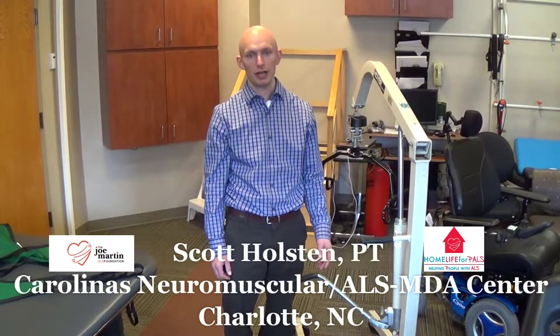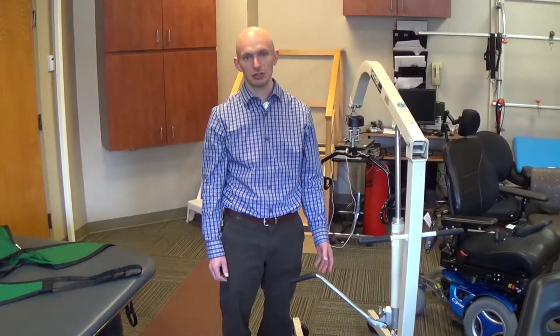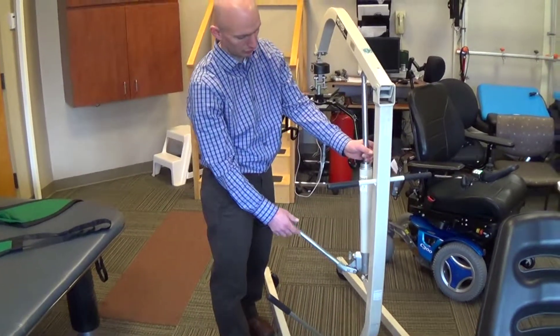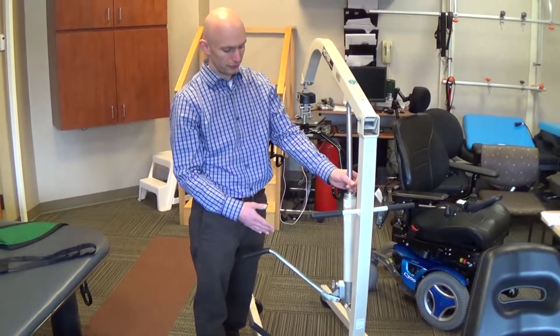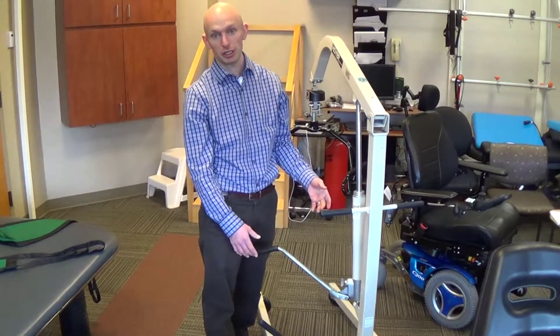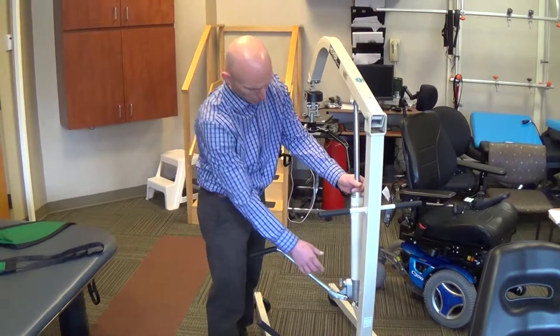I'm going to go over how to complete a hydraulic patient lifter transfer and the components of a hydraulic patient lifter and sling. This is a manual hydraulic patient lifter. They also come in powered options. The manual lifts are what are typically covered by insurance, so this is what we will demonstrate.